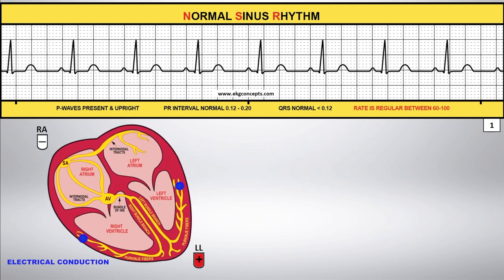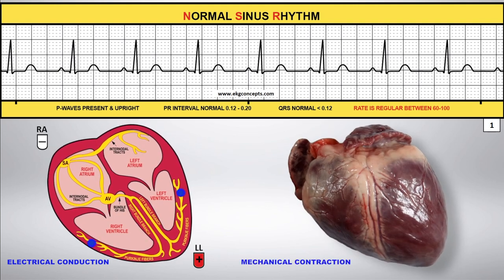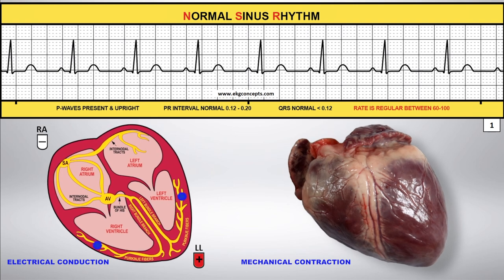Here we have a heartbeat of 75 beats per minute. The impulse originates in the SA node, then travels downward throughout both the right and left atria. The impulse then travels through the AV node, the bundle of His, through both bundle branches and into the Purkinje fibers where it causes ventricular depolarization.